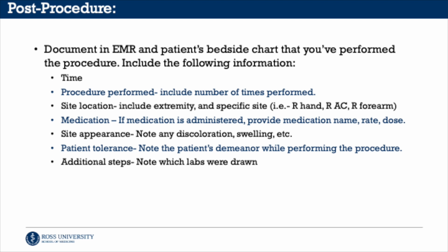For the post-procedure, be sure to document it in the EMR, including time, procedure performed, site location, medications if they were administered, site appearance, patient tolerance, and any additional steps which were taken during the draw.